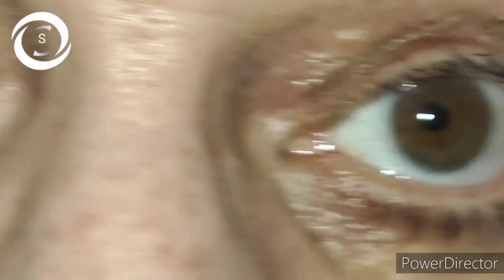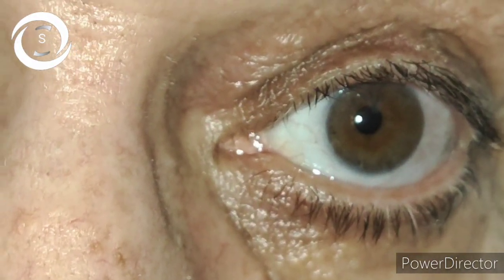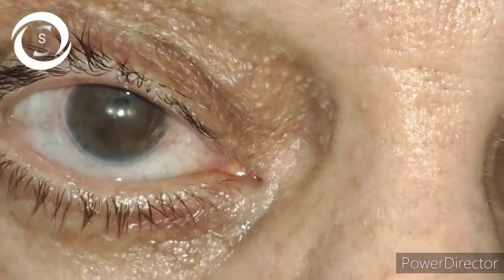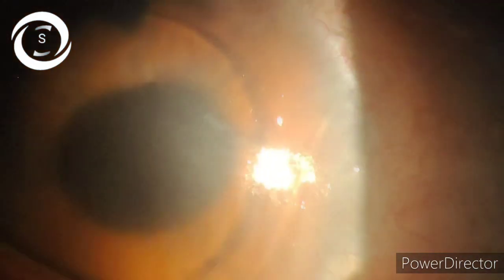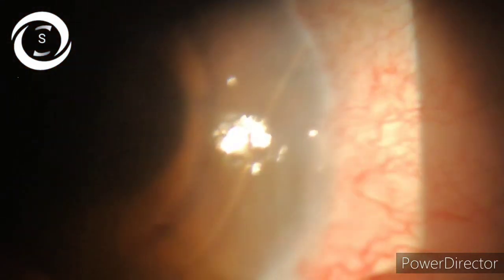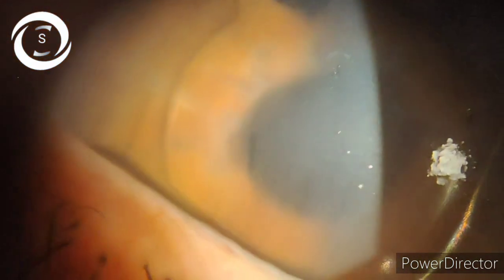Looking at the pupils of both eyes, you can see the bright reflex indicating the patient is bilateral pseudophakic. However, the right eye reflex is different — the cornea is hazy and there is an anterior chamber IOL implanted. Intraocular pressure is raised at 26 mmHg in the right eye and 12 in the left. There was hyphema in the right eye with inflammation cells and flare in the anterior chamber, while the left eye is quiet with good vision.